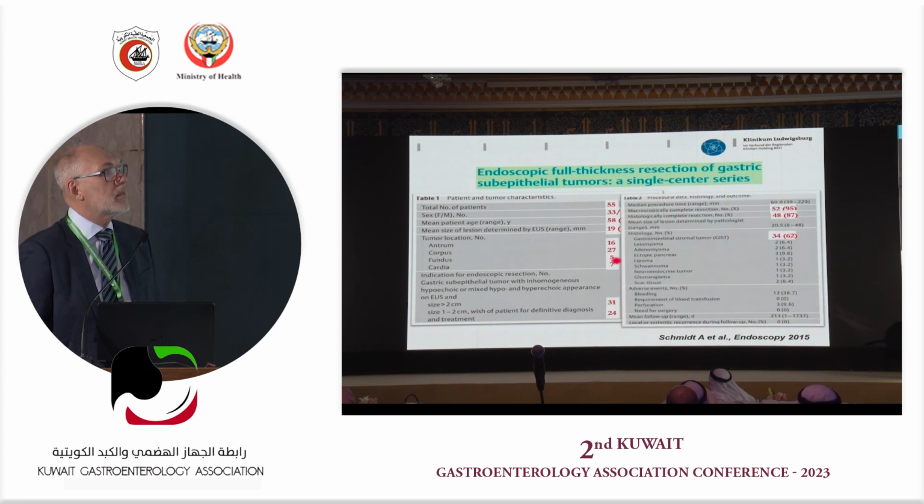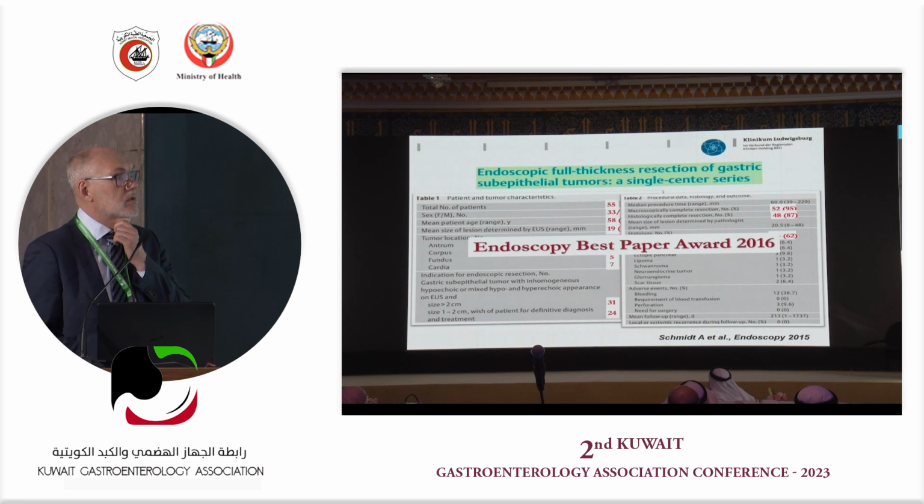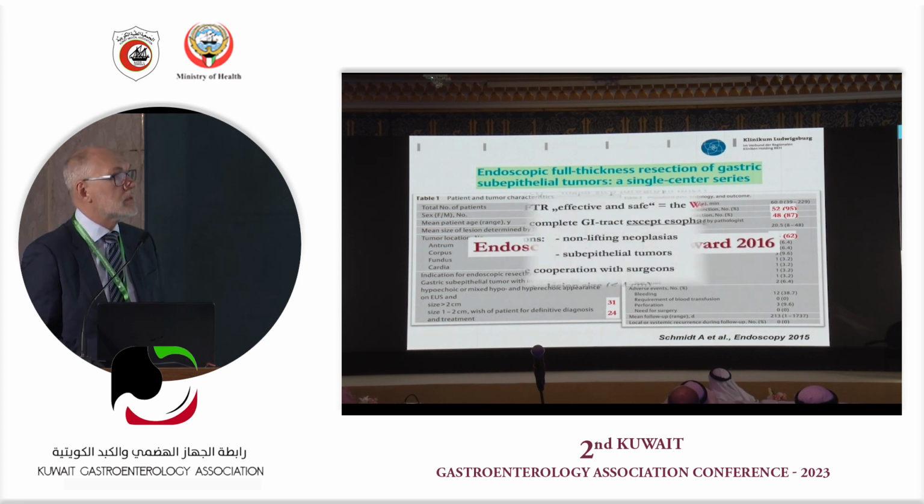We had macroscopic complete resections in 95%, histologically confirmed R0 resection in 87%, GIST tumors 62%, and we had only minor complications, no need for surgery, no death, and we received for this the Endoscopic Best Paper Award in 2016.